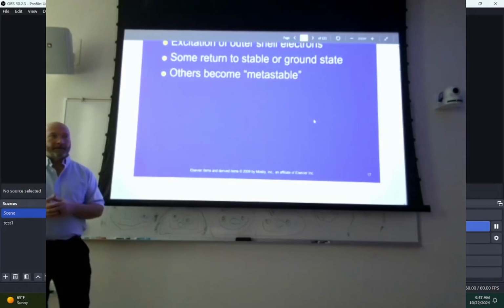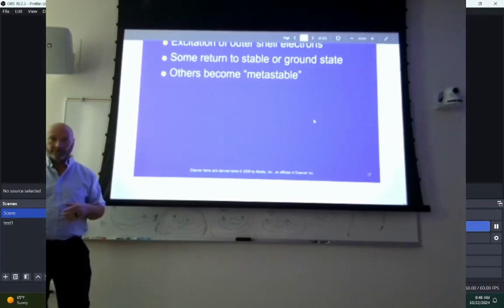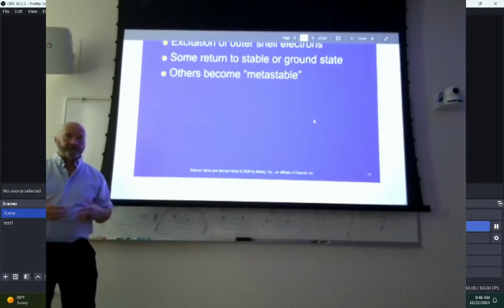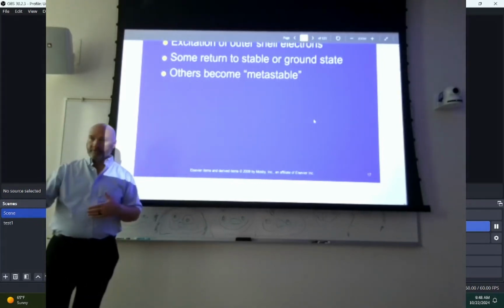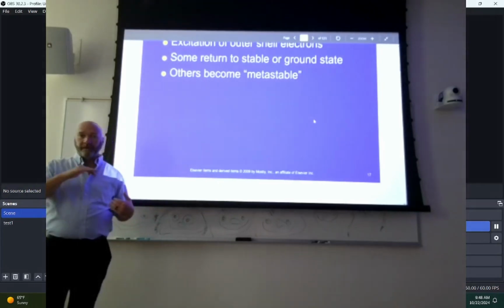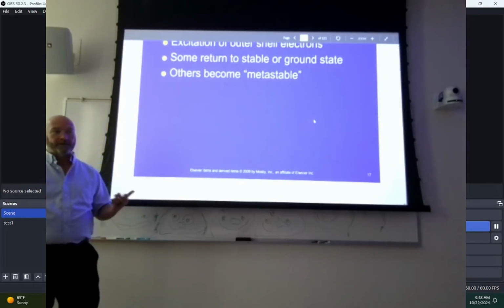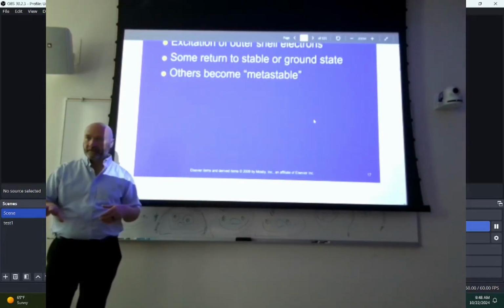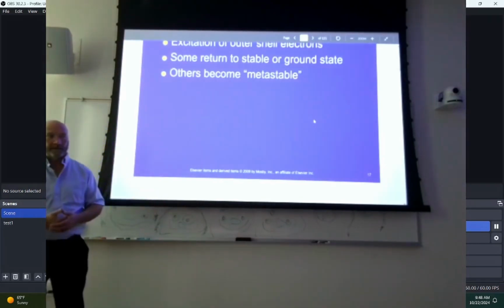And what I mean by that is the problem with CR plates is if you're assigned to portables and you're in a big hospital that shoots a lot of portables, you may have a stack of CR plates. You may have to go up to the floor, and it may take you a long time to take all the x-rays you need to take. And then you've got to come back downstairs. You got to feed those into the reader, right? Unlike the DR systems you're using now where you get the image immediately, these things had to go to a physical place to be processed.